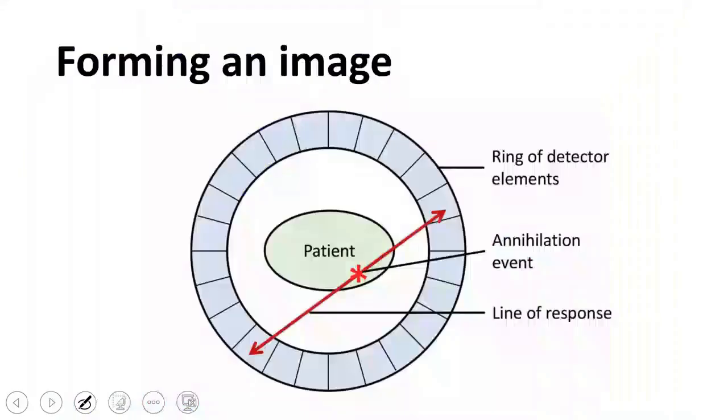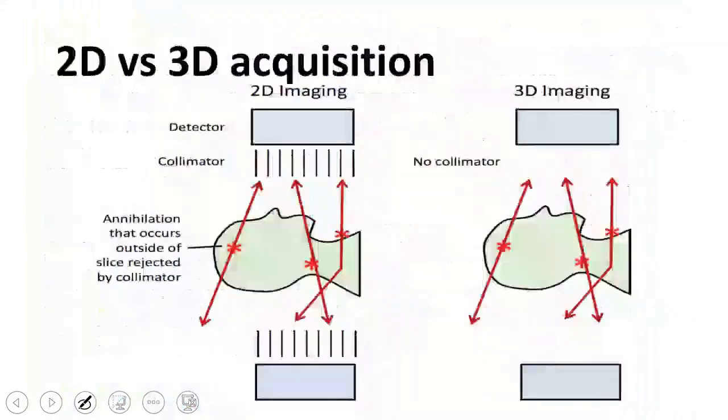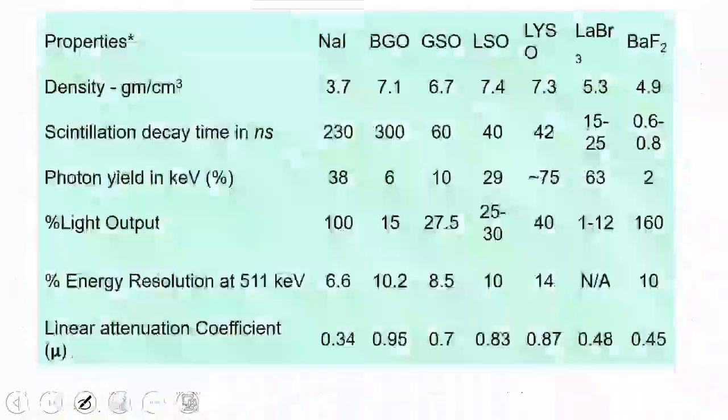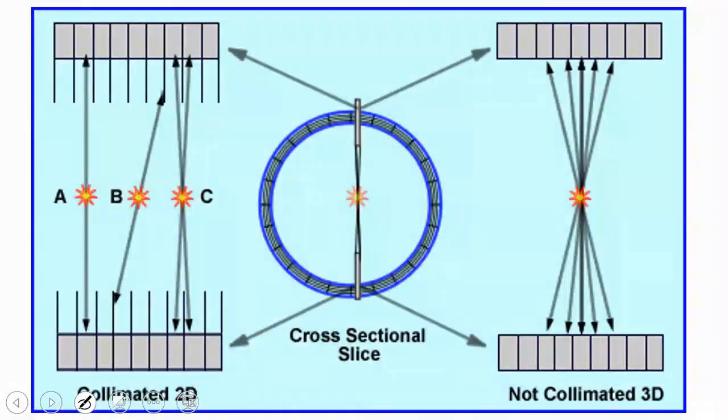You take a cross-section like this. Take a cross-section from the rings that are present. I have here, for example, 3 or 4 rings available. Take a cross-section. So this is ring 2, 3, or 4. All these are available rings. They created something called 2D mode and something called 3D mode.